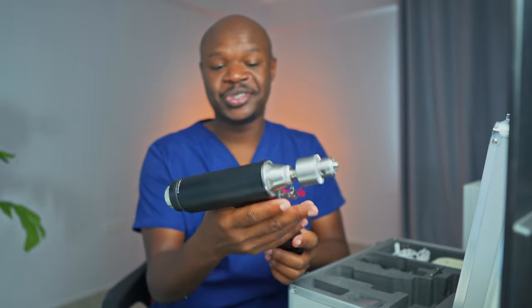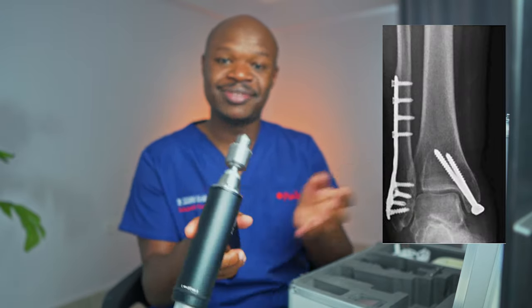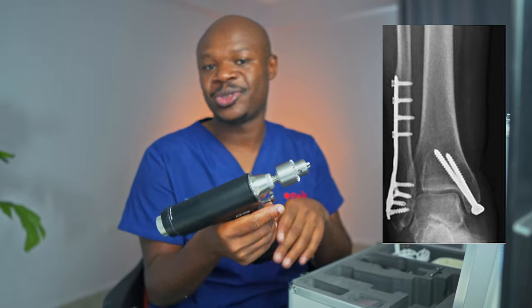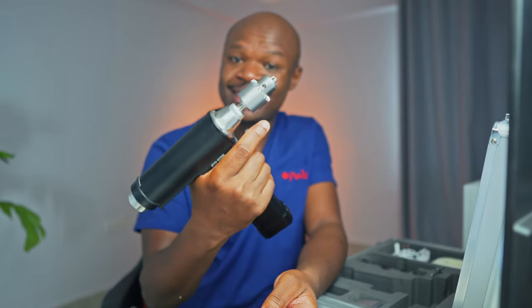We use this in surgery to actually make holes in bones so that we can get screws and such other devices for the purpose of fixing fractures or performing some other orthopedic surgery procedures. And literally, it's just a drill.